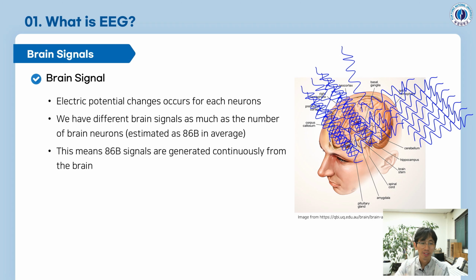We have just around 8 parts of the muscles of our heart, so it's pretty simple. Let's think about the EOG. We have only 2 sources, left eye and right eye. And even these 2 eyes almost move together. So this is pretty simple.